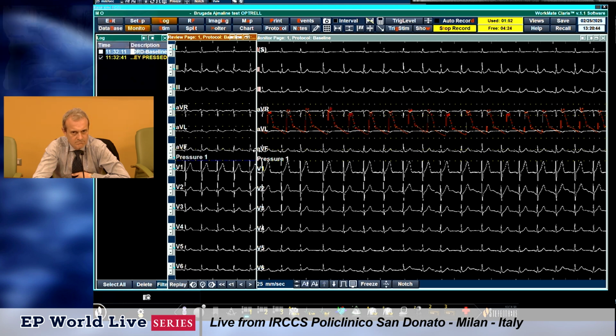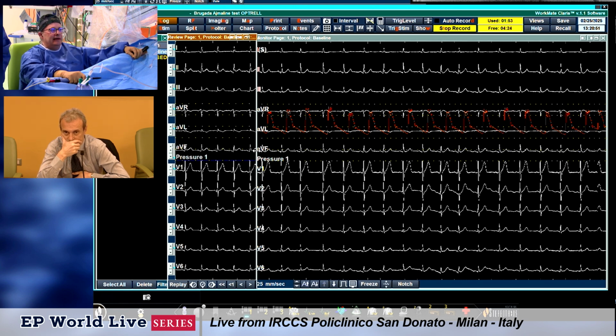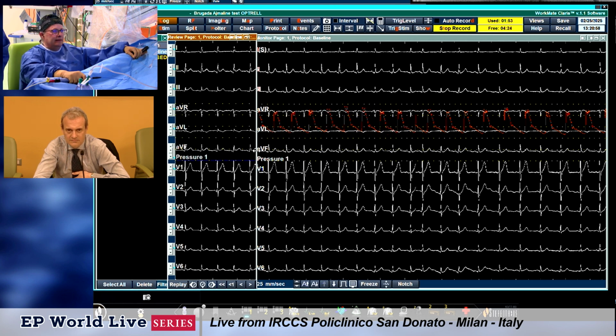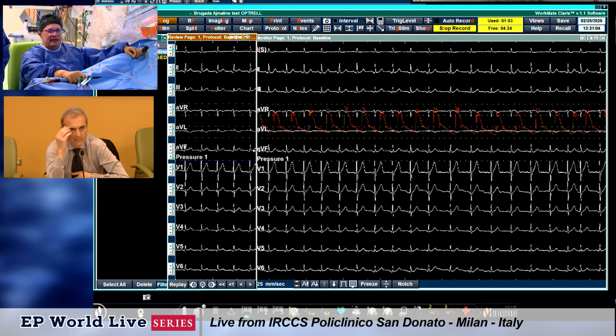Can you emphasize the EKG with the video camera and amplify the EKG, because I don't see the early repolarization anymore. Yes, yes, he is doing it. Pre-excitation. Can you amplify? Amplify a little, Alessandro. He is not able to do it. Amplify the ECG.